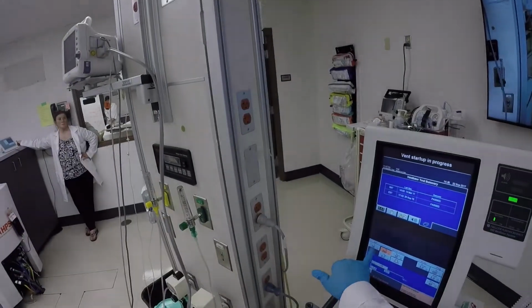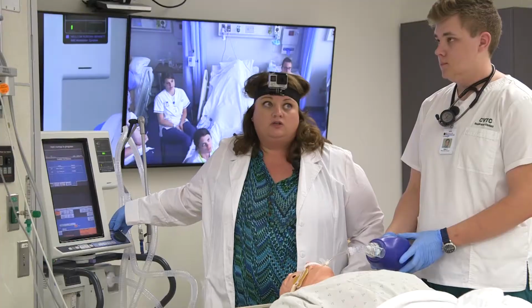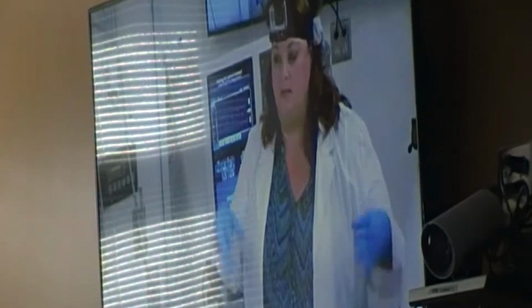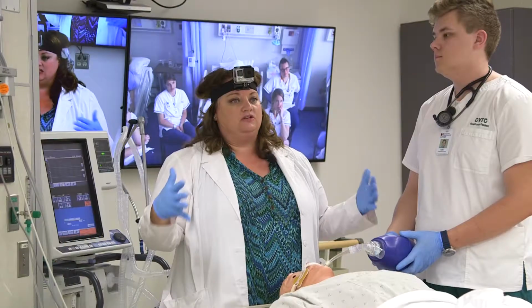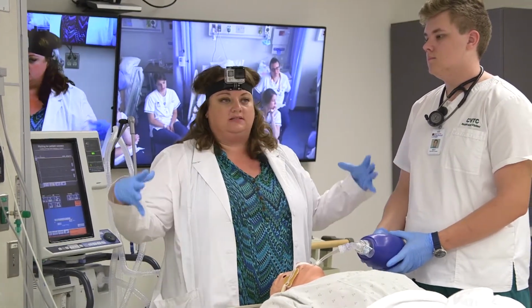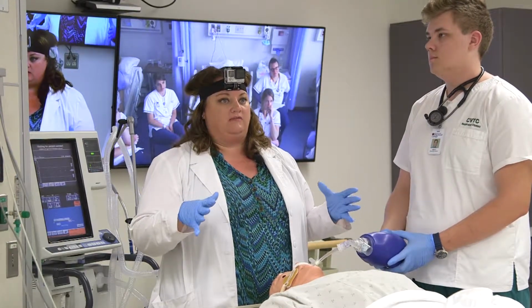The other settings we got to do is we got to set him up on a respiratory rate. A normal rate when we put someone on a ventilator is somewhere between 12 to 14-ish, so I'm going to put him on 14. So for Patrick, because he's an asthmatic and he's in the middle of a status asthmaticus attack, he's already going to have a lot of intrinsic PEEP. His airways are obstructed, air is going to go in, it's not coming back out. So he's probably got a ton of intrinsic PEEP when I put him on the ventilator.